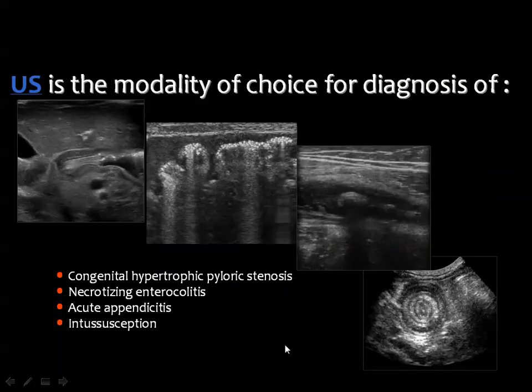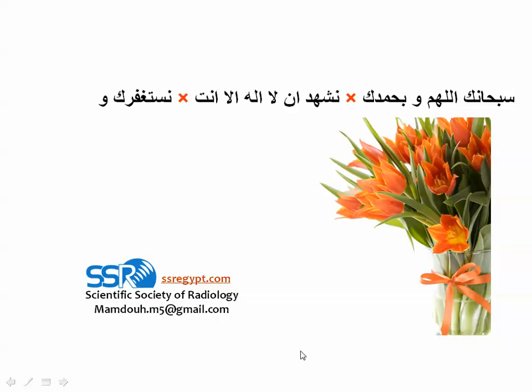Ultrasound is the modality of choice for diagnosis of congenital hypertrophic pyloric stenosis, necrotizing enterocolitis, acute appendicitis, and small and large bowel intussusception. Thank you very much.